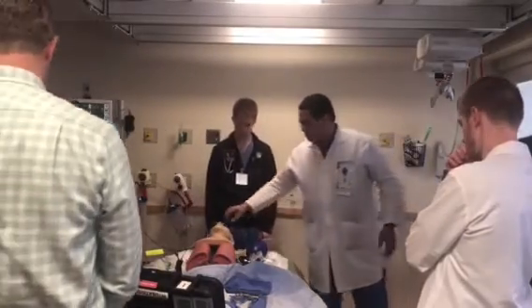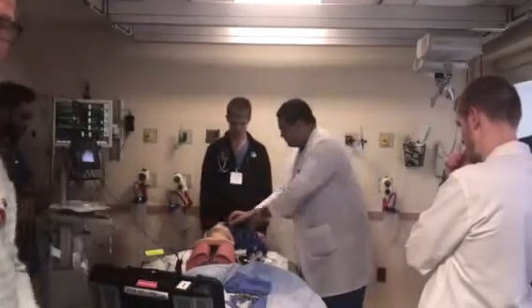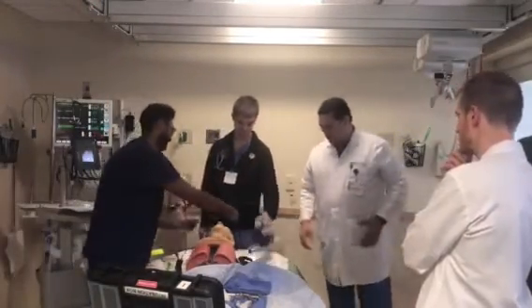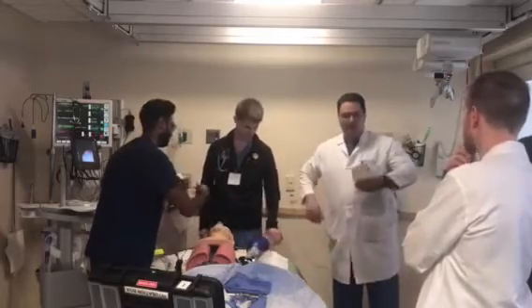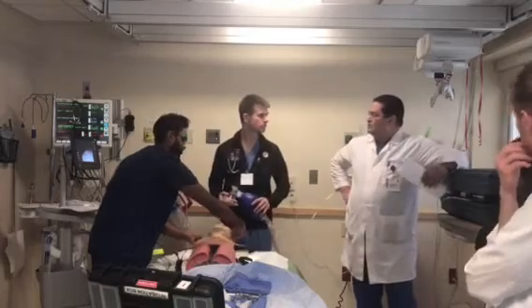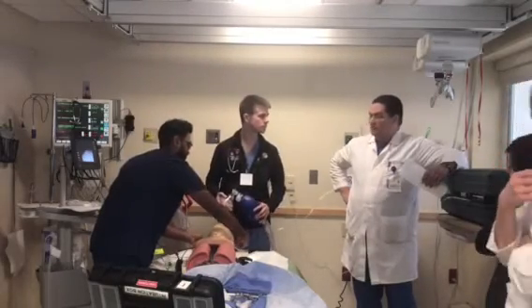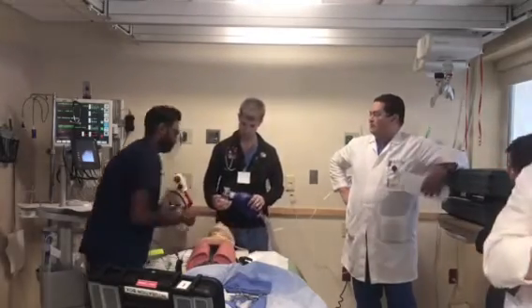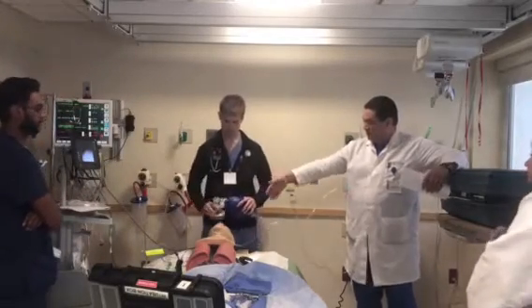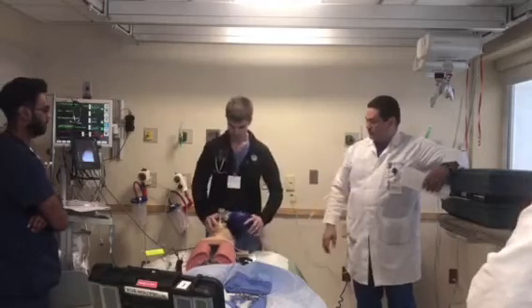So there's another scenario now. Robbie, put it on the patient. All right, so we have another scenario. Last scenario. So now the patient is not only difficult in ventilation, he cannot be ventilated. His saturation now is 75%. You put the mask on him, and you're ventilating as much as you can, and he couldn't.